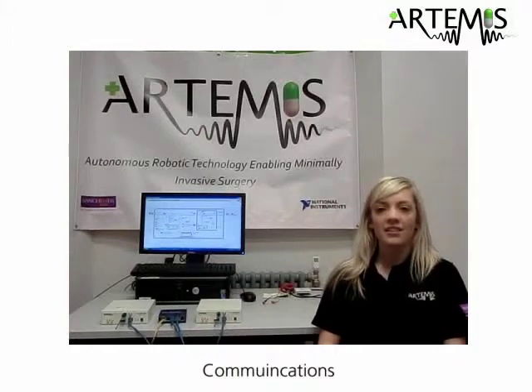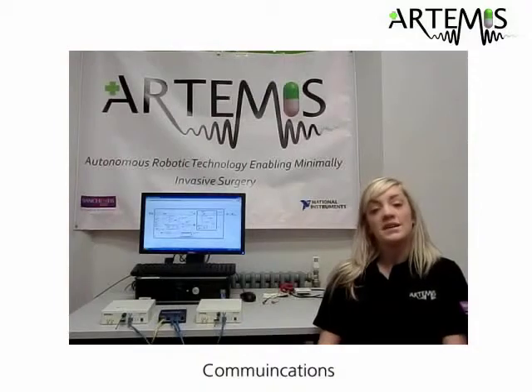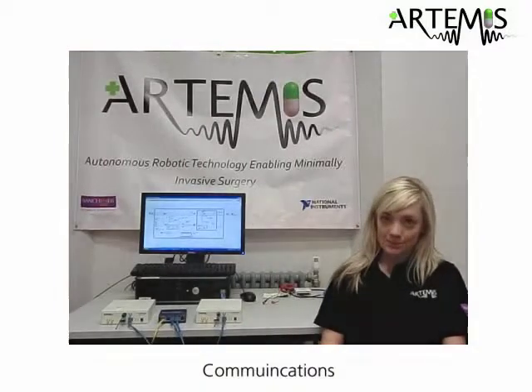A further use of the USRPs was to test the final system. They were set up to act as controlled interferers with the same modulation schemes as some 433 MHz modems. This allowed us to see how our final system coped with interference from other radio sources, which would be extremely important as the patient may not receive the treatment they require in some medical use cases if communication between the base station and the capsule was lost.